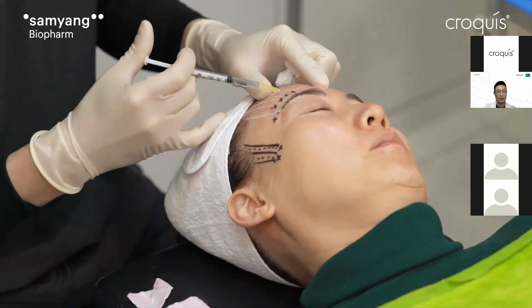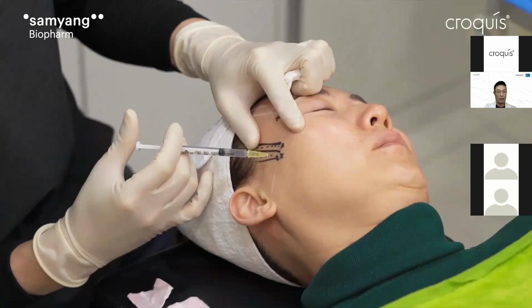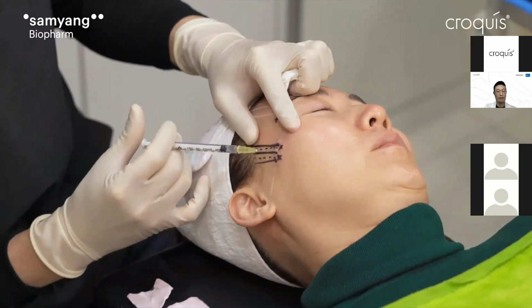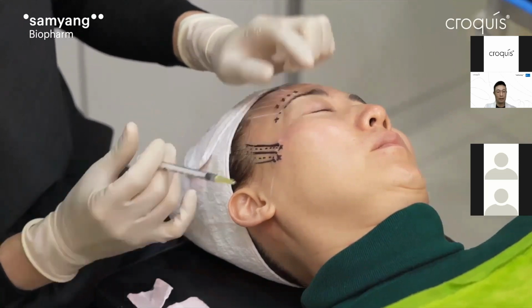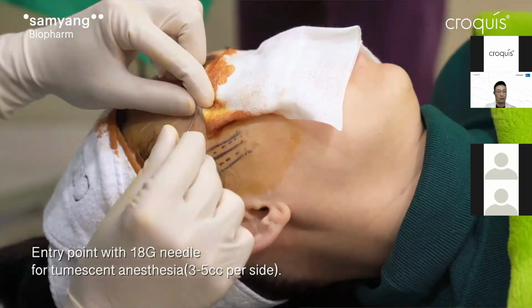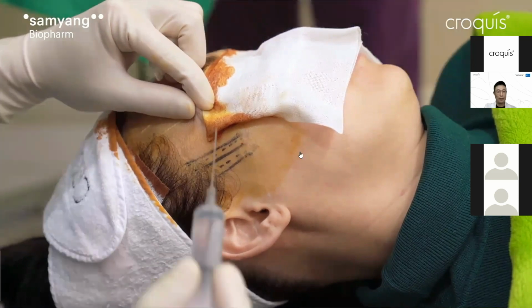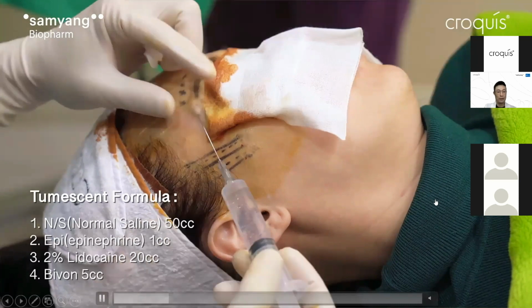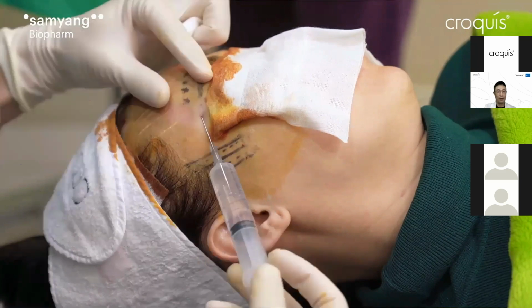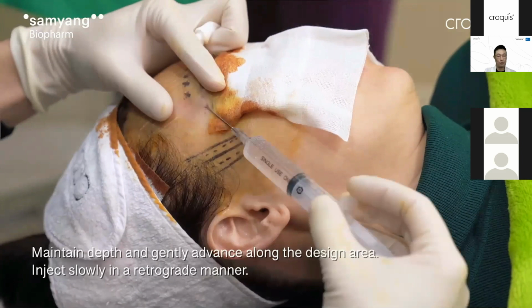First, I'm injecting on the entry points. When injecting on the entry points, it's better to inject enough amount of lidocaine within the full depth of the dermis, because I will use an 18 gauge needle as a needle puncture. You see, I'm holding the entry point with my left fingers. It's to avoid any bleeding, and in order not to lose the entry point.